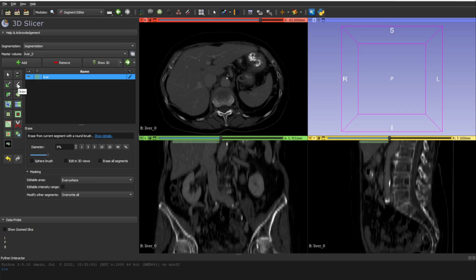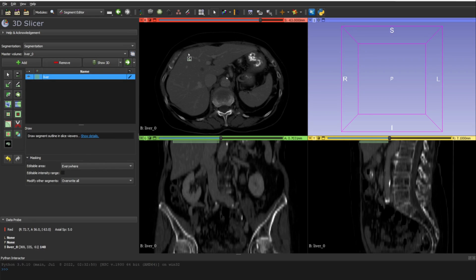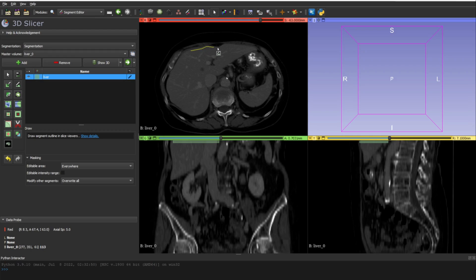This next tool is called Draw. What it does is let you place points along the borders, and then a mask is created based on those points — they form a polygon, and from the polygon the mask is generated. Let's start by clicking to place the first point, then continue tracing the polygon around the structure, trying to be as precise as possible.